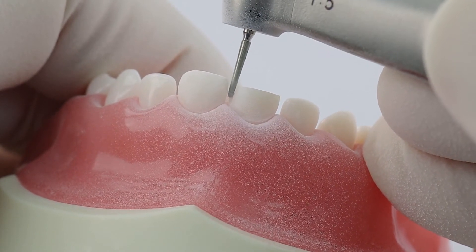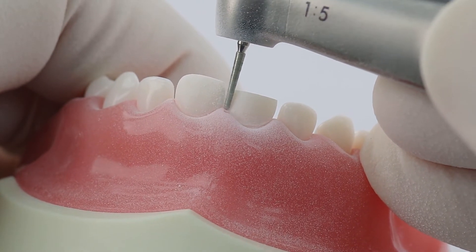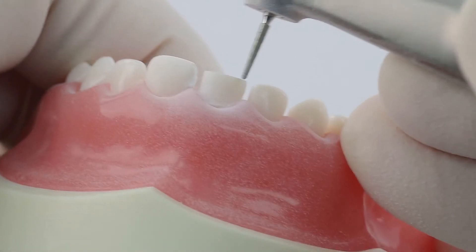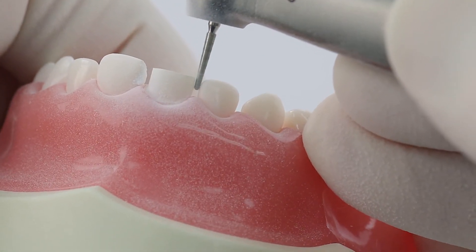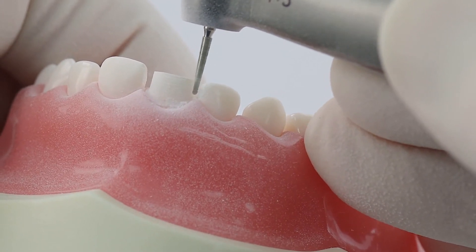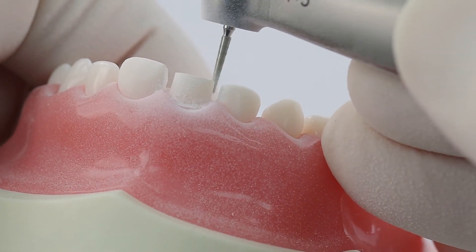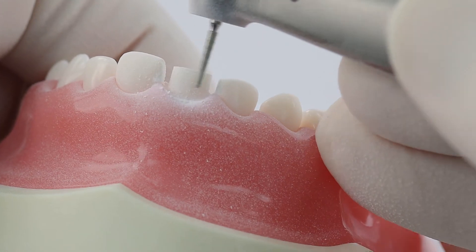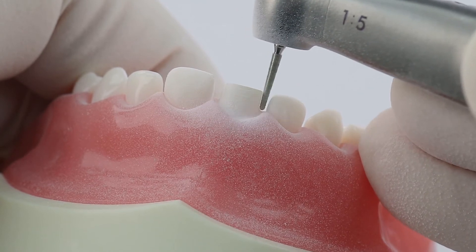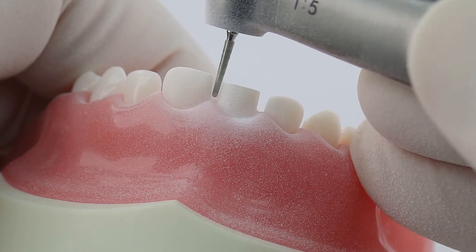As we're going interproximally, I always like to look at the side of the burr and just barely miss the tooth that we're not prepping. Then we'll do this side here — make sure we miss the tooth that we're not prepping. And then we're just going to finish defining our racetrack, the thickness of that burr.